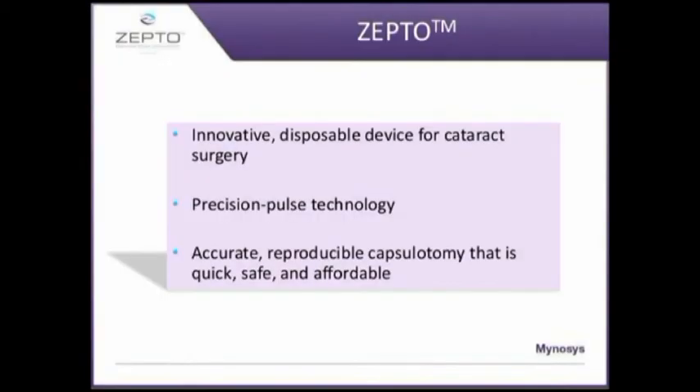ZeptoCataract is made by the Minosys company and is marketed by the Care Group in India. It is an innovative disposable device for creating capsulorrhexis during cataract surgery, and it creates accurate reproducible capsulotomies that are quick, safe and affordable.